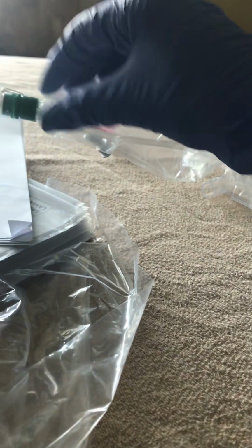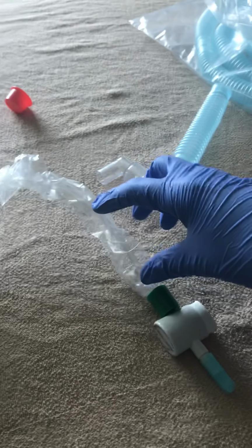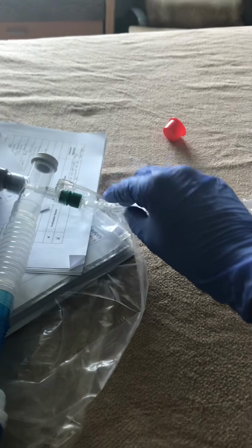Once we are suctioning, we want to bring back that plastic so it's a nice push in and pull back. It's hard to do with one hand, but if we have it all bunched up, we're not actually getting that little bit of tubing that needs to go down into the patient. So it's good practice to pull that back to prevent that resistance.